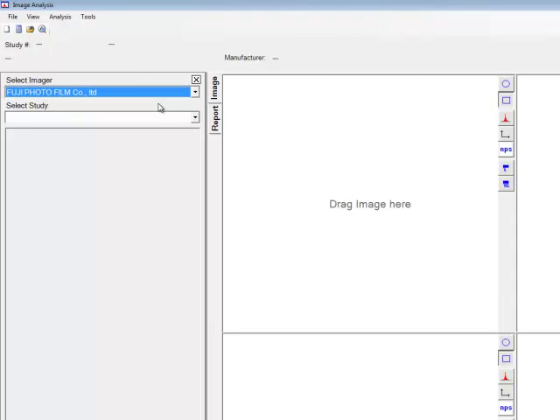Note in this example we have the Fujifilm company shown, but other manufacturer systems can be easily added. Following that, they will open the study section beneath it and select the images they want to work with.